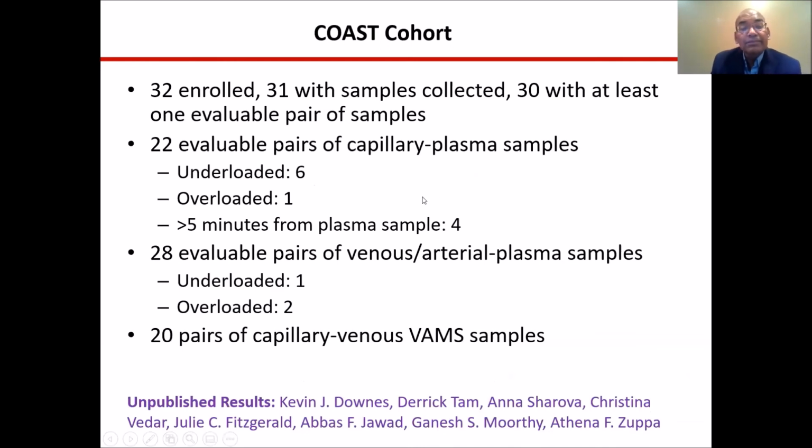As you could see, in this COAST study, we enrolled 32 pediatric subjects, out of which 31 had samples collected and 30 had at least 1 evaluable pair of samples, and 22 evaluable pairs of capillary plasma samples were in the study. And some of the issues that we have encountered is that at the time of clinical sample collection, sometimes the samples were underloaded, meaning that the Mitra tips were not fully collected with blood samples, maybe due to a challenge of collecting appropriate volume of blood.